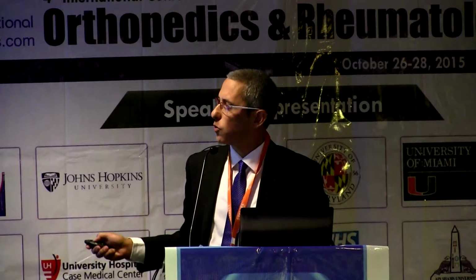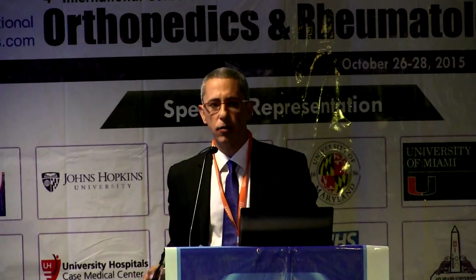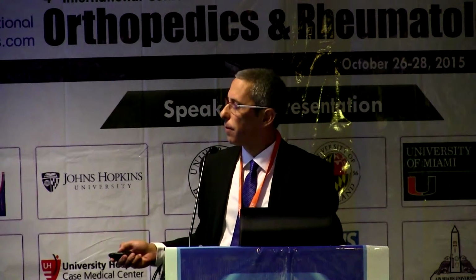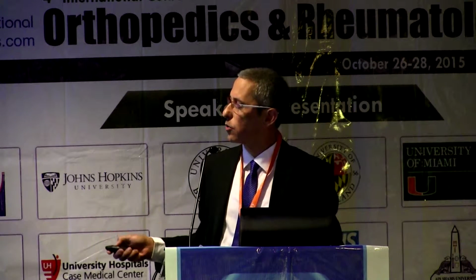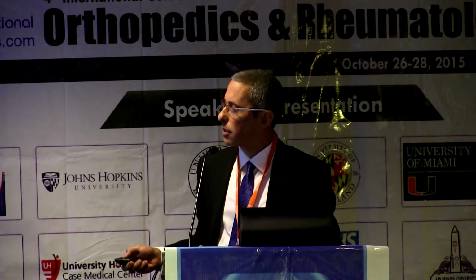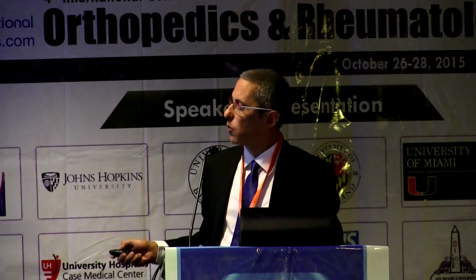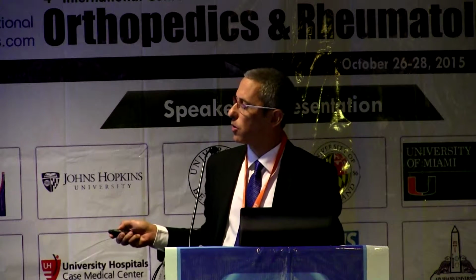At that stage, we measure the length of the tear in order to know what size of InSpace balloon we're going to put inside. This is the balloon, how it comes folded. It has to be in the right direction and the right length. And the next step, we're going to inflate it with saline. So now we can actually see through the balloon. This is the cork, which will seal the balloon at the end of the procedure.